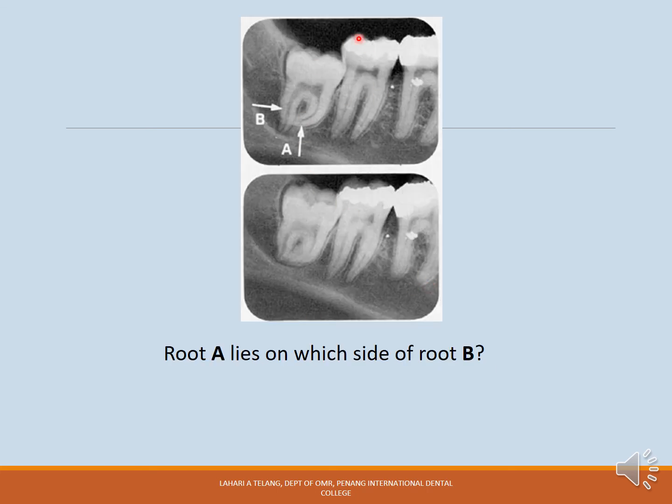Now, if you look at the first radiograph and the second one, what you notice here is that in the second radiograph, you see more of the lower border of the mandible, and hence it's easy to make out based on these two radiographs that the second radiograph has a different vertical angulation. Perhaps this is with 0 degrees vertical angulation and this must be with a minus 10.